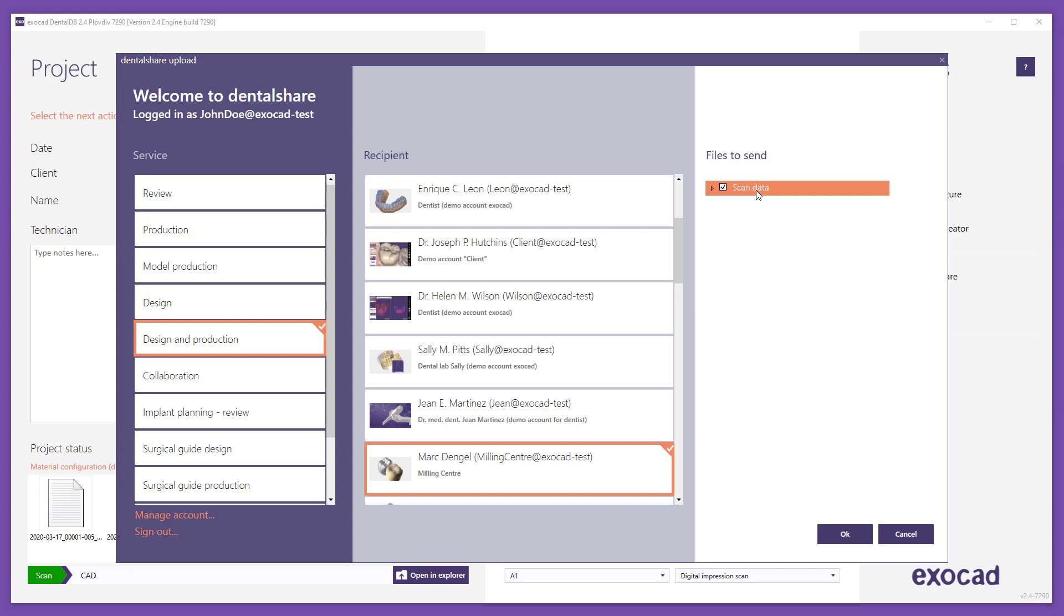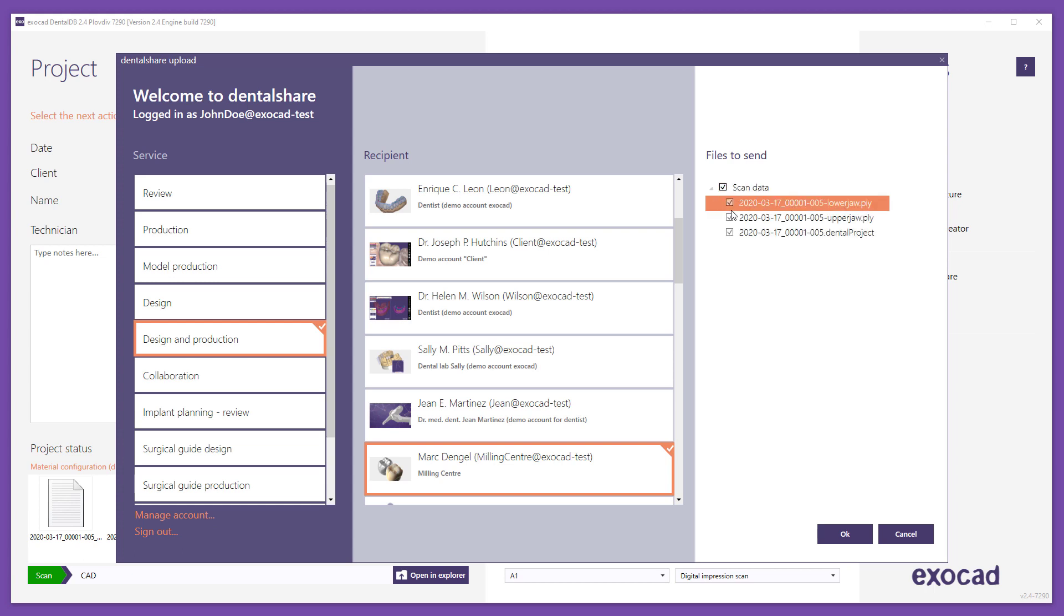By activating the corresponding checkboxes, you can select or deselect the data you wish to send. The list of data displayed depends on the selected service: scan data, design data, production data, model production data, and review data. Using the triangle icons in front of checkboxes, you can expand file lists of a certain category. Sending Dental project file is required for the recipient to receive DentalShare data and to be able to open the project in DentalDB.